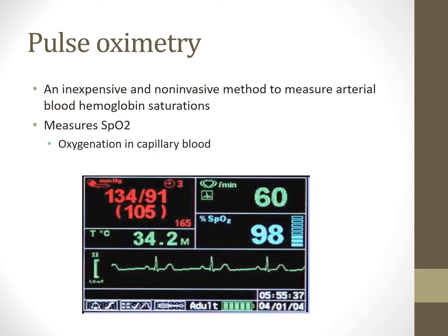That's why the arterial blood gas is still going to be the gold standard for oxygenation management or oxygenation monitoring. So this cannot replace the ABG for accuracy, no matter how strong these get, unless there's some way to actually look at oxygen on the hemoglobin molecule, then there's no way that it can really overcome that currently.